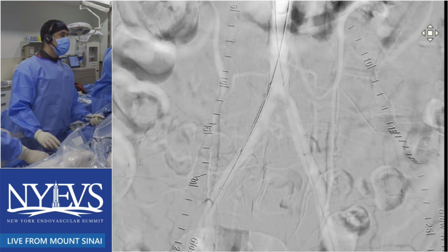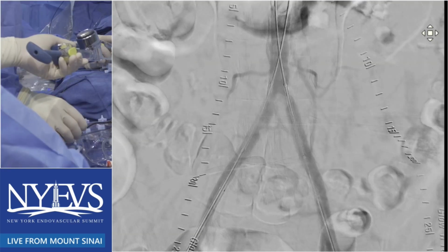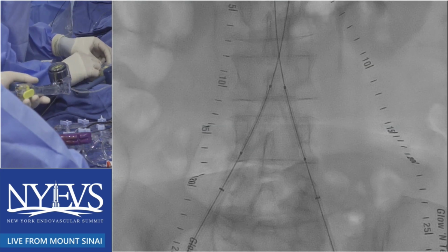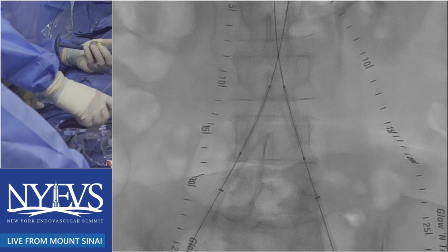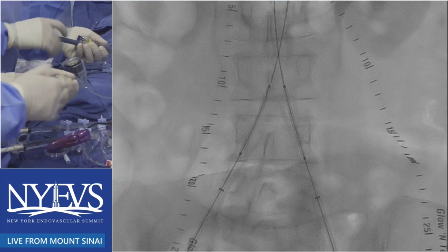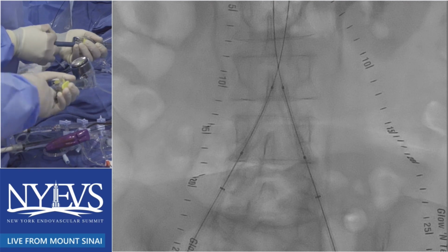Let me go again. Pull back a little bit. Yeah, I'm going to pull back. I think that's a good angiogram that shows this disease oftentimes isn't just the iliac artery, it extends into the aorta too. And that's generally why I would extend this about 5 millimeters or so above the bifurcation, because the last thing that you want to do is have a technical issue right at the leading edge. That's why these things will fail.